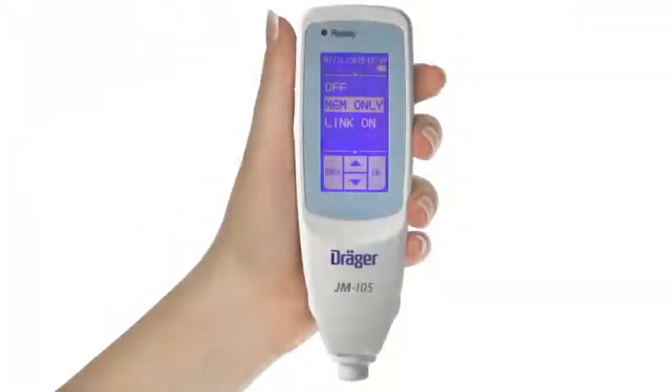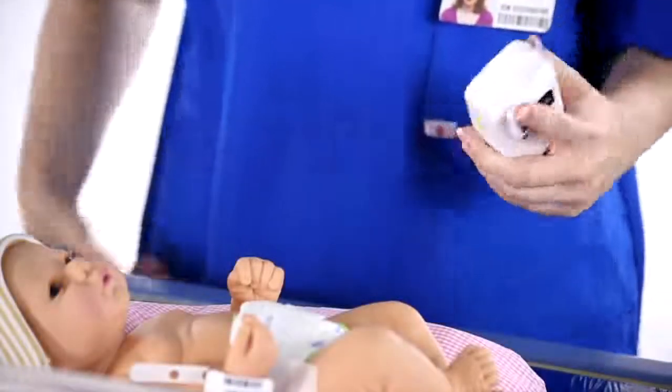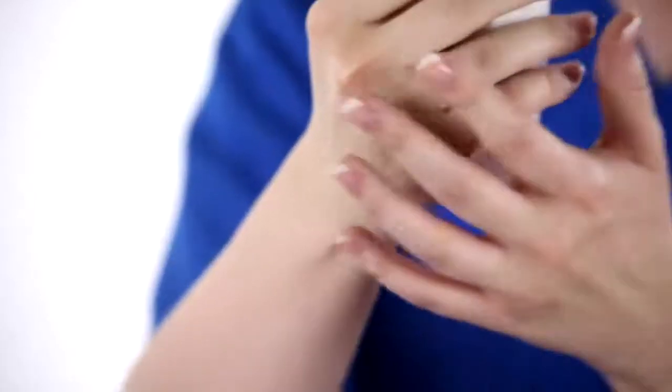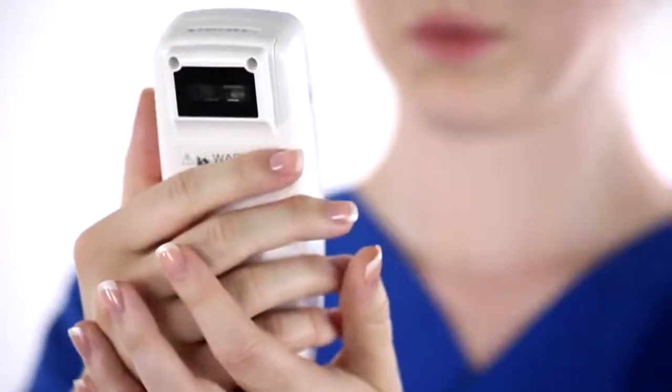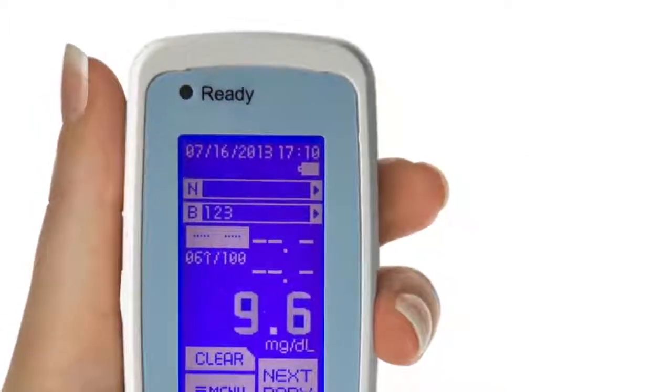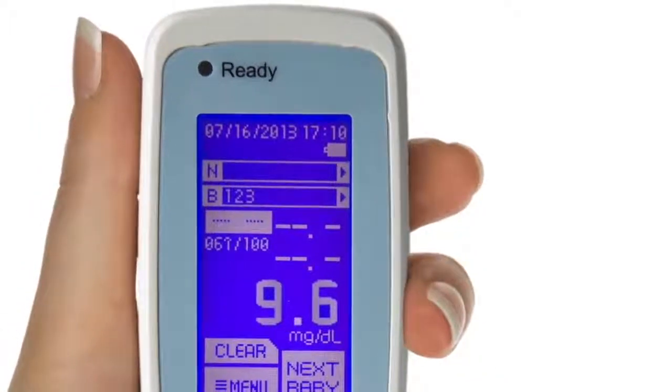A feature on the JM105 touchscreen allows you to flag a baby's jaundice measurement in memory only and link on modes. The first is Priority Flag, which is useful if you are taking transcutaneous bilirubin measurements on many babies in succession. You can attach a priority flag to the result indicating that this result is in need of prompt attention. A priority flag is attached right after taking a measurement when the final average value is displayed.